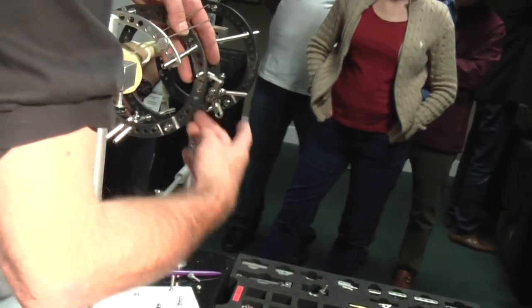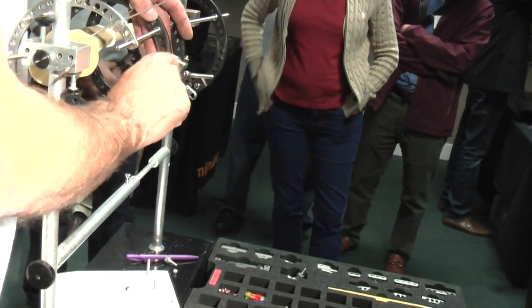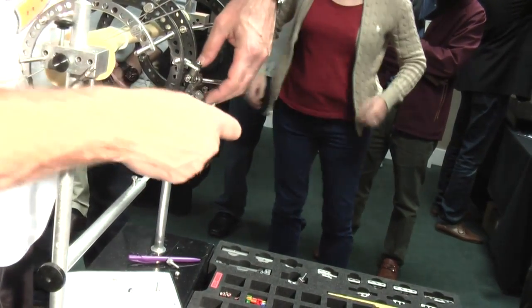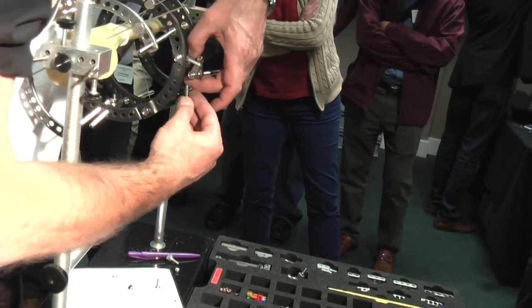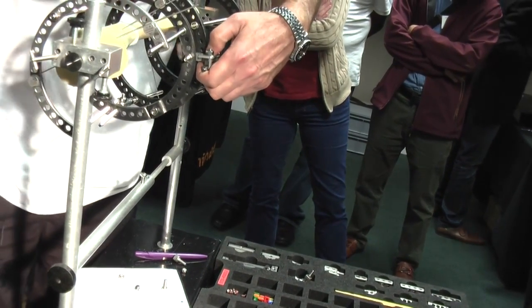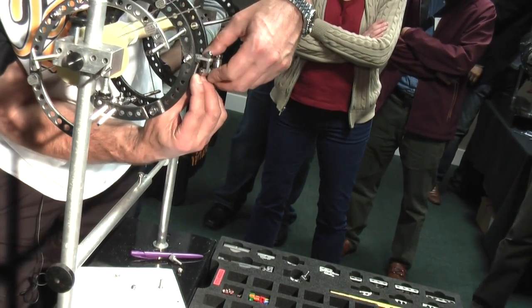No. It's a very good point. At the end of the day, as long as they all end up the right length, then the bone will go straight. You eyeball them basically where to put the motor. It's where the rings are closest together. Where the rings are closest together is the point of convergence of the frame. Because the rings are mimicking the deformity. Yes, exactly.